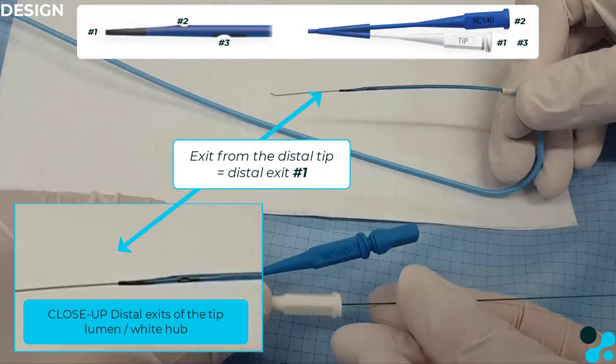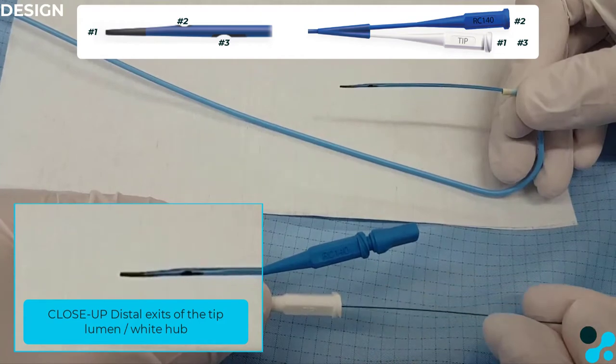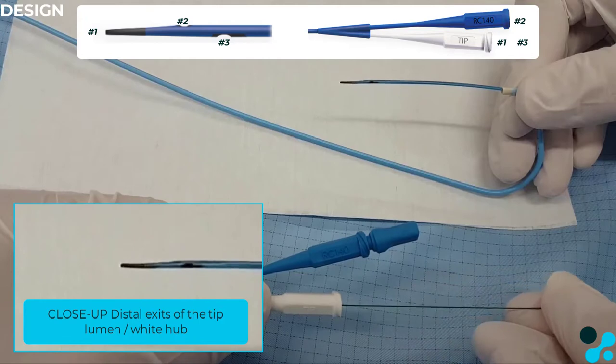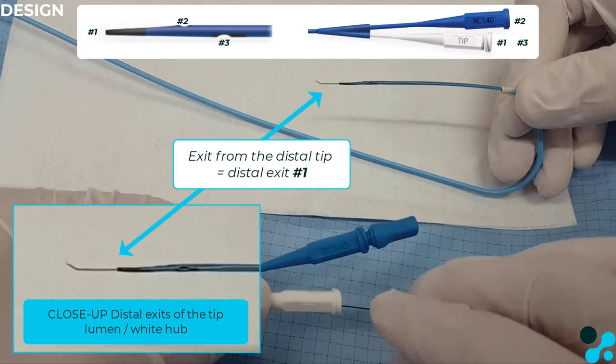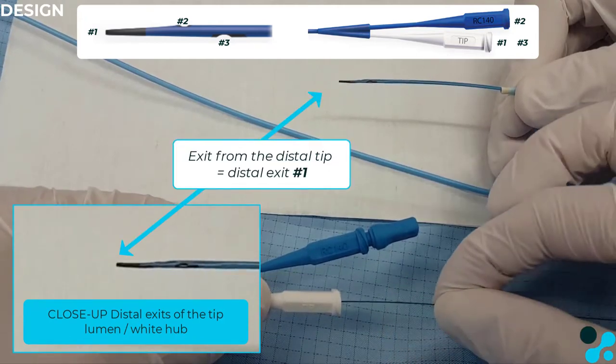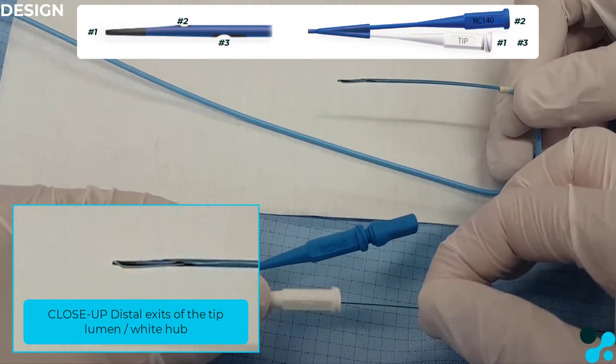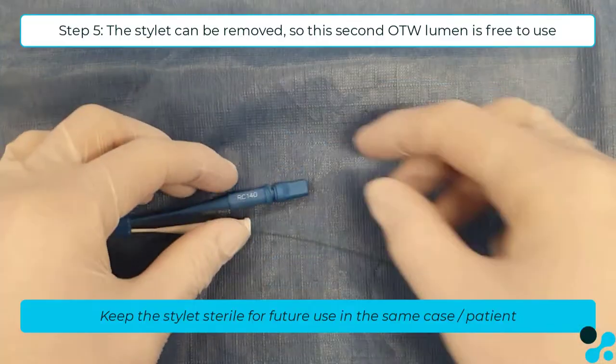The white hub is connected to the tip and to additional exit port number 3. The white hub, which is marked as tip, is connected to both the tip and the proximal exit port. The guide wire should always be slightly shaped, and depending on the rotation of the guide wire at the proximal end, it will come out of either the tip or the proximal exit port.